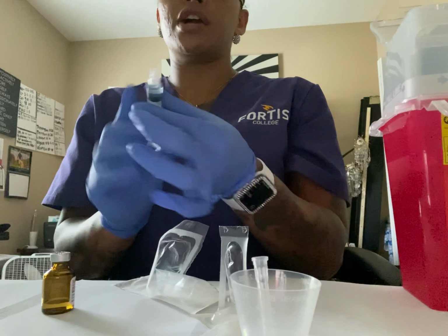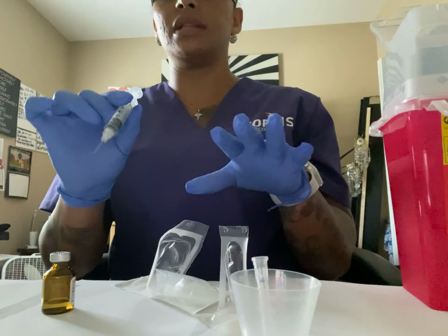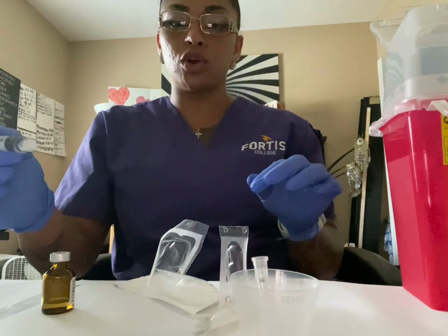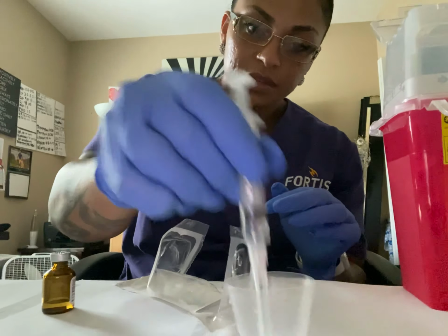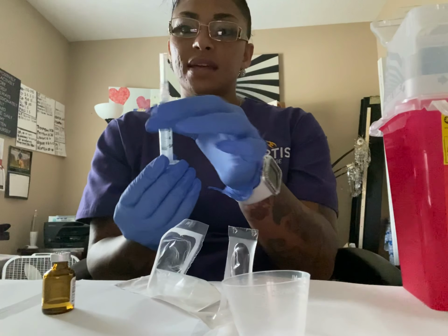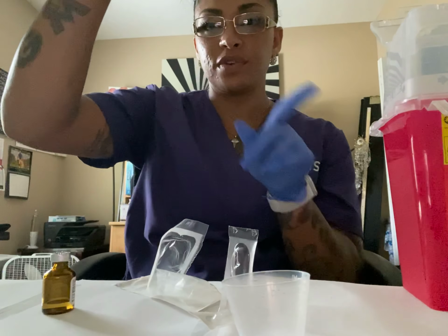And then after administering the medication intramuscularly, which needs to be administered immediately, we're going to recap our needle. Just like that. And then we're going to dispose of the syringe and the needle into our sharps container. Okay, and that is how you administer medication from a vial. Thank you.